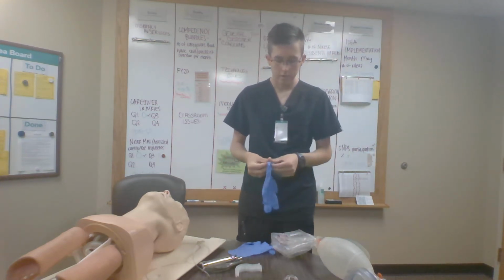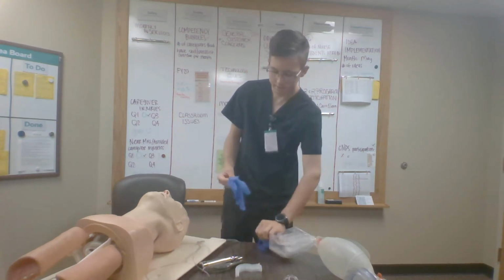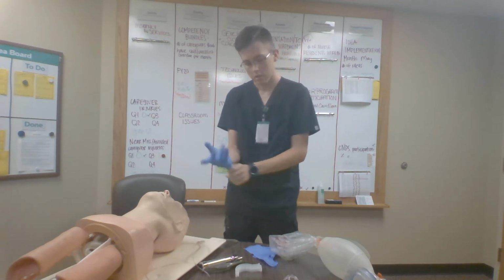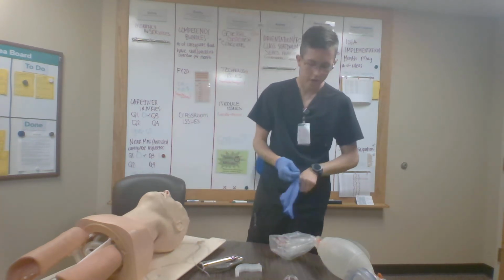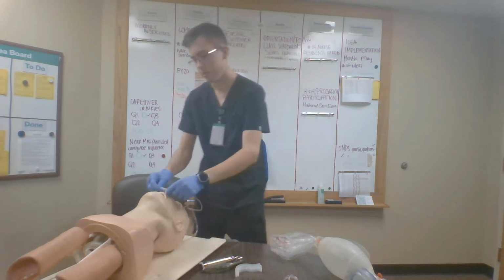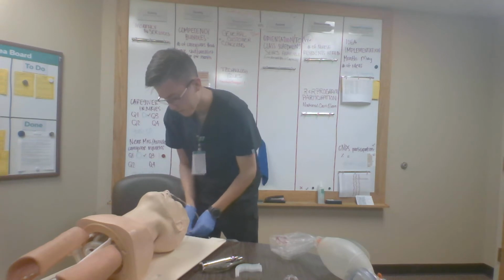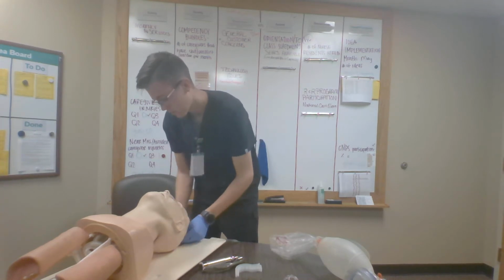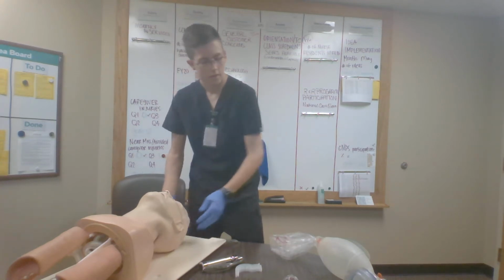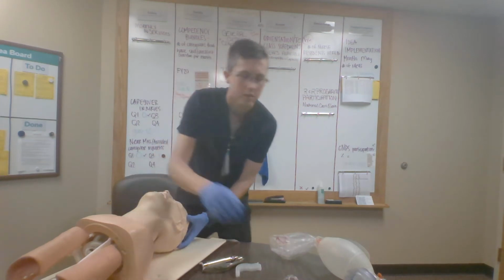So after you've gathered up all your materials, I am going to put on proper PPE. And then in an attempt to pre-oxygenate my patient, I'm going to go ahead and put him on a high flow nasal cannula. Okay. And then I'm also going to manually open up the airway, see if there's any secretions.